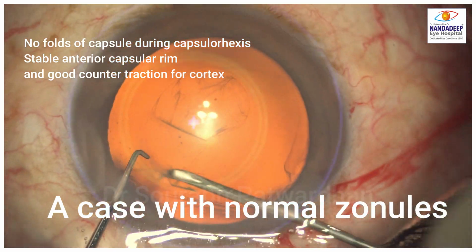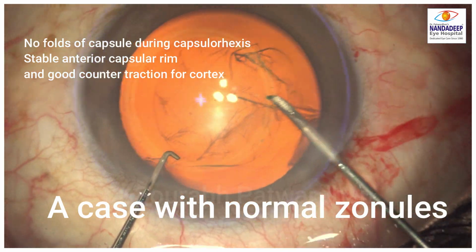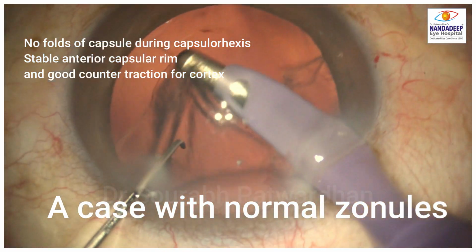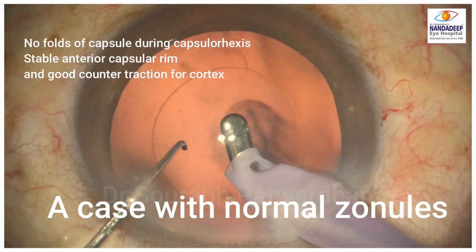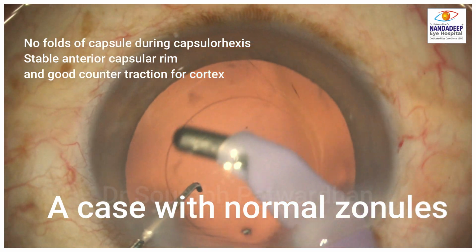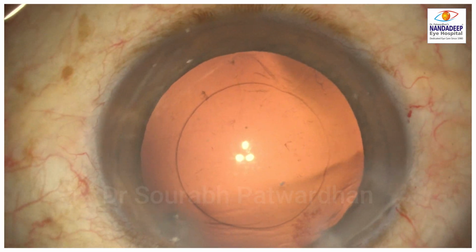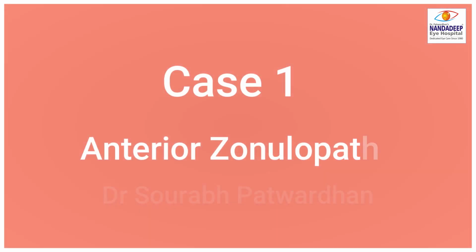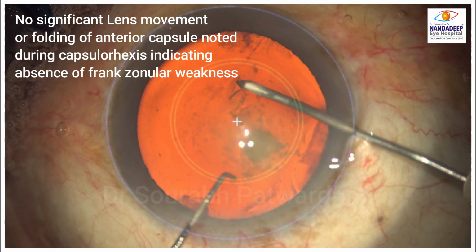The same is true with anterior zonulopathy, where only the anterior limb of the zonules has laxity or weakness. In a case with normal zonules, what you can observe is that during capsulorhexis, there is no movement of the lens, no folding of the capsule, a stable anterior capsular rim, and the bag held by zonules gives good counter traction during cortex removal. Now let's see the first case where anterior zonulopathy can be experienced.